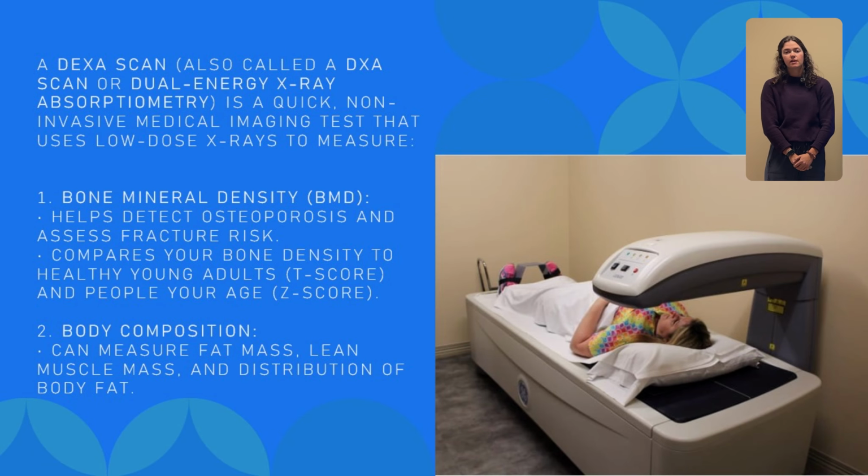So what is a DEXA scan? Well, a DEXA scan is a medical imaging device that collects information to measure someone's bone density. We can use that information to evaluate the risk of developing disease such as osteoporosis or risk of fracture. It is also used to measure someone's body composition, where we can use it to track changes of fat or muscle tissue over time and also estimate someone's risk of developing different metabolic disorders by evaluating their visceral adipose tissue percentage within their body.